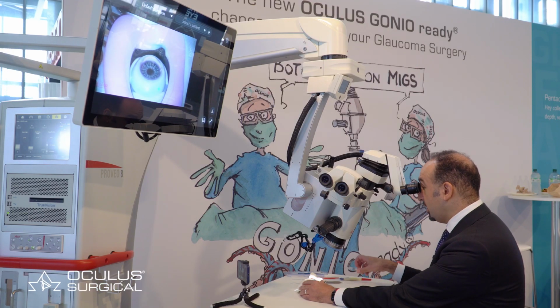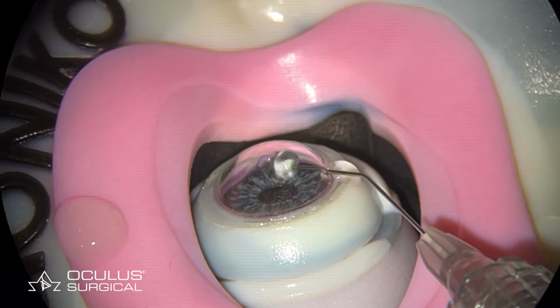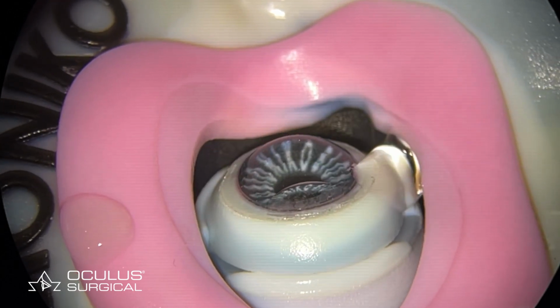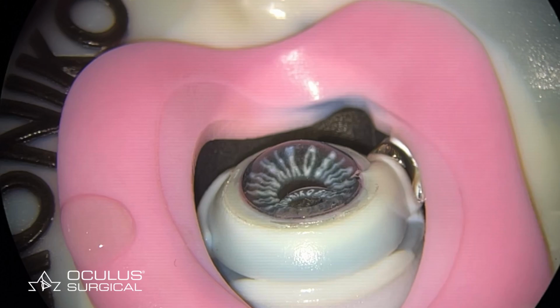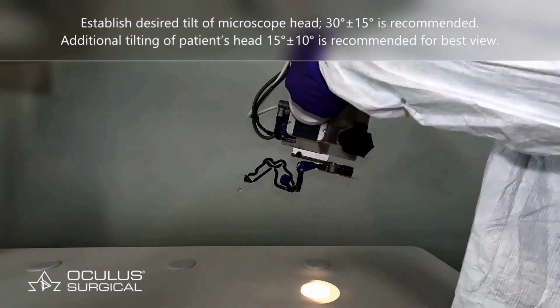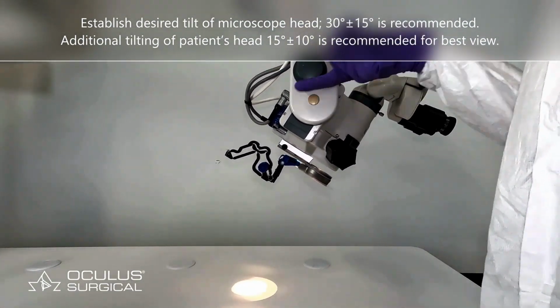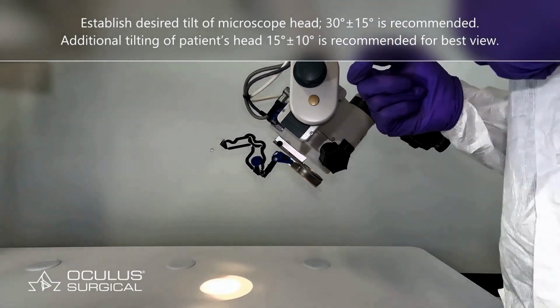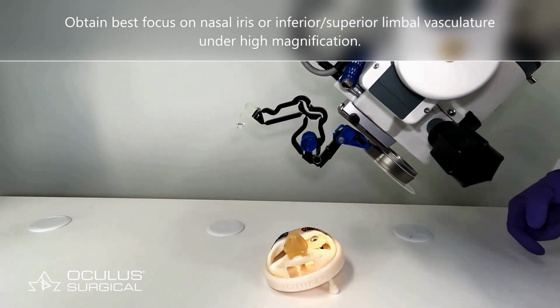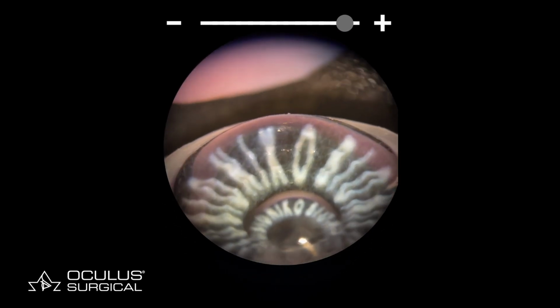And then some OVD to fill up the eye. Get a nice good fill there. And then the next step here is to establish focus and best stereo using the system. Here the eye has been tilted away from the operating surgeon. The operating microscope, of course, is tilted towards the surgeon. At this point what we want to do is zoom all the way in and center on the nasal iris there.